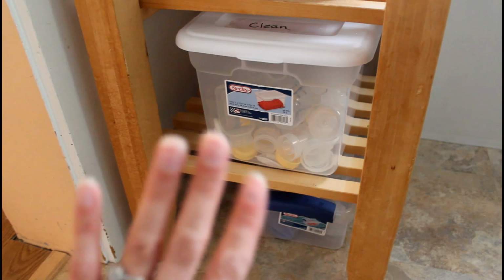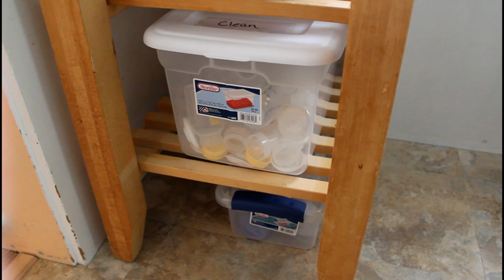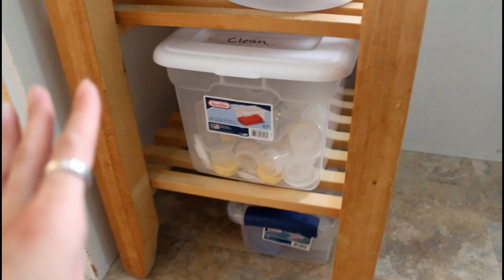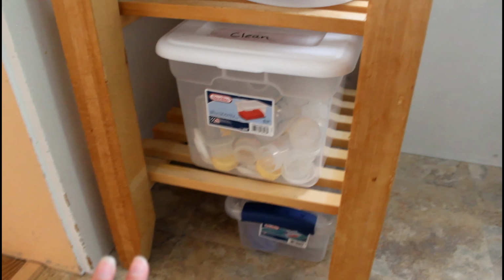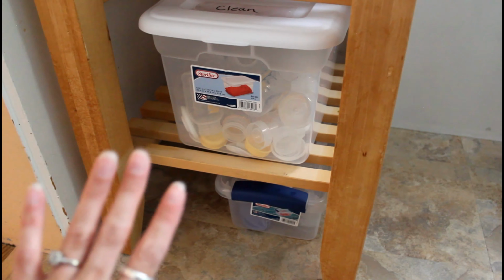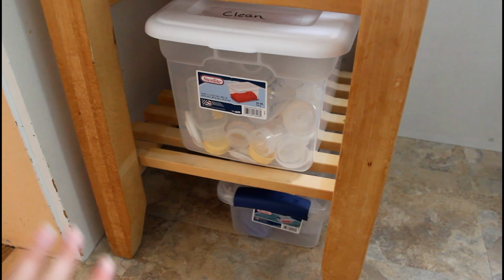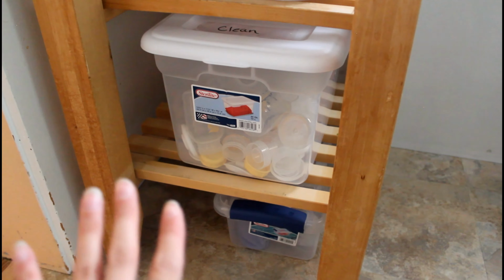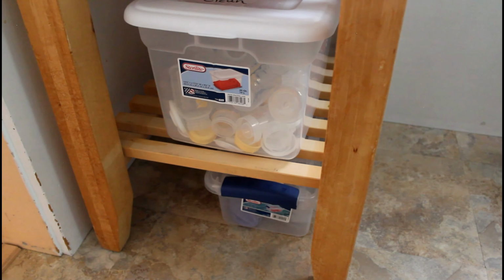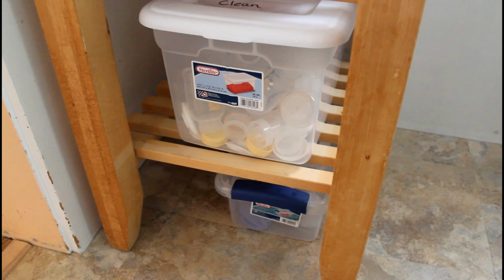Before I get to that little bin though, you don't necessarily have to be this sterile with a full-term baby. The only reason why I'm being this sterile is because I'm donating to a preemie bank. You can by any means be this sterile for your own baby. That's totally fine, but I don't want to put out there that everybody has to do this. I'm only doing this because of the NICU babies that I'm feeding. But if I had a full-term baby, obviously I would clean everything and sanitize them once a day like you normally should do, but I wouldn't have all these parts. I would just be using the fridge or pitcher method.